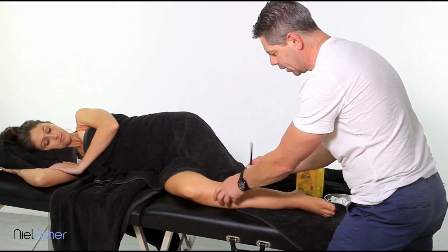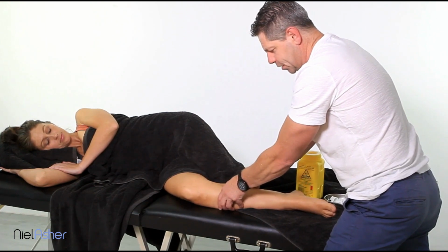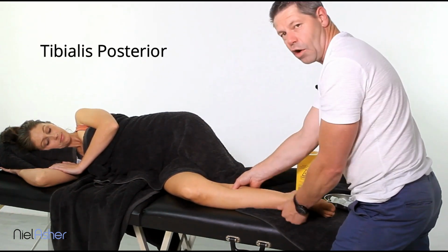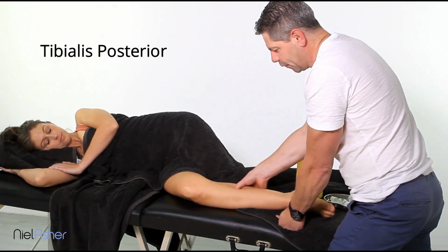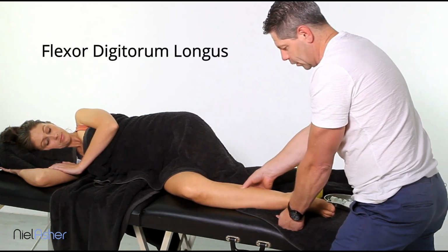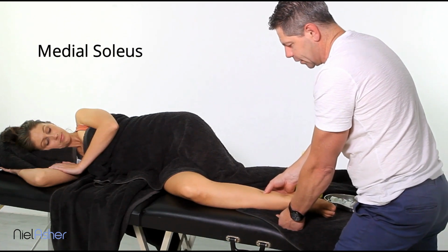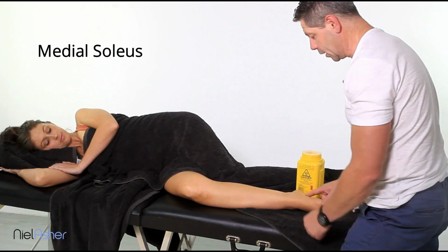Second one, we're going to come down a little bit further, a little bit more distal, and we're going to pick up the tib post, which is about here. Once again, right at the back of the tibia itself. And then we come down a little bit further from there, maybe another finger width down, and then we've got the Flexor Digitorum Longus. Come all the way down here, and then we'll hit the Medial Soleus as well. And that can actually refer pain into the foot and into the Achilles.